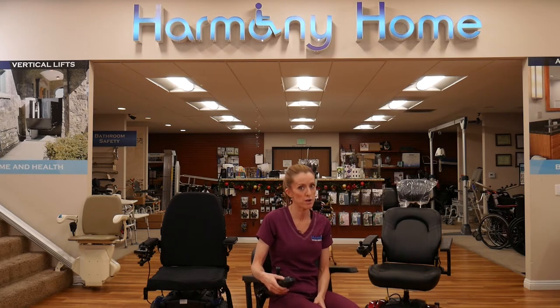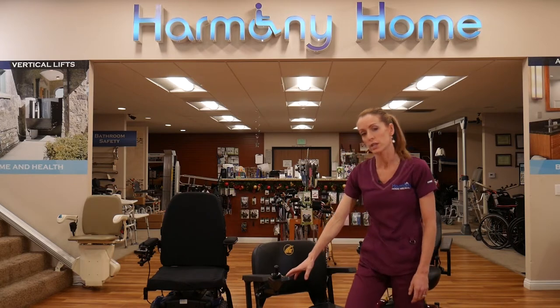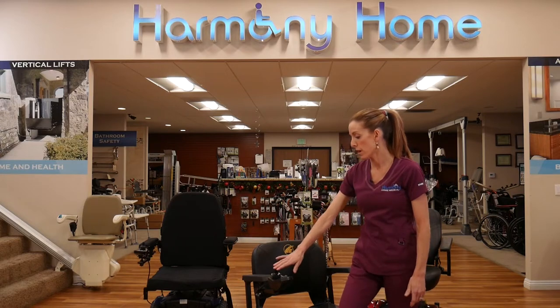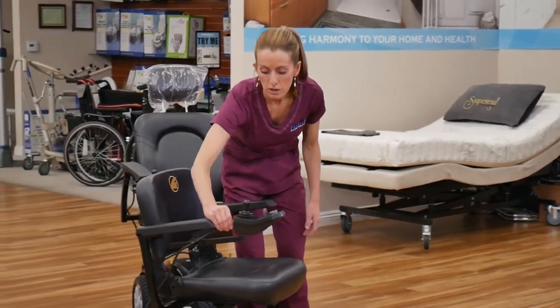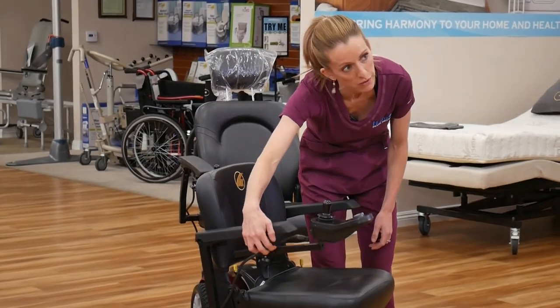Pretty simple — you have a horn in case anyone needs to get out of your way. We always want to turn the power chair off when getting in and out. You do not want to have it on and accidentally hit your joystick, so make sure the power is down.